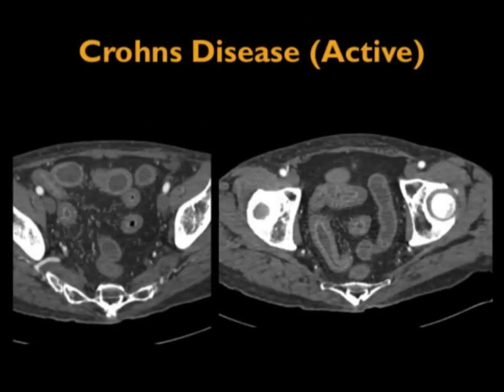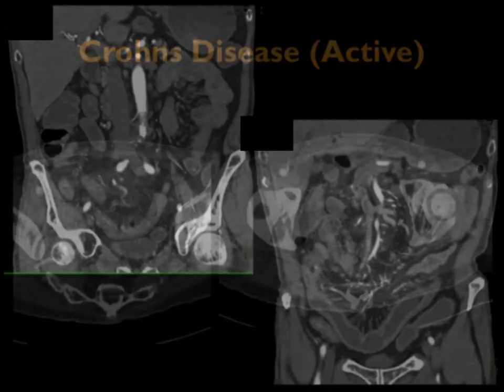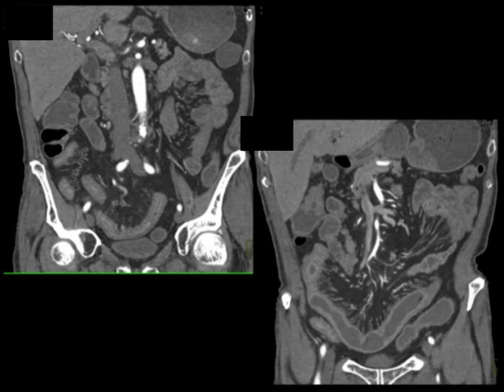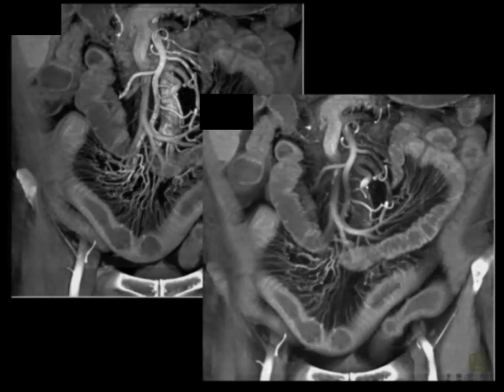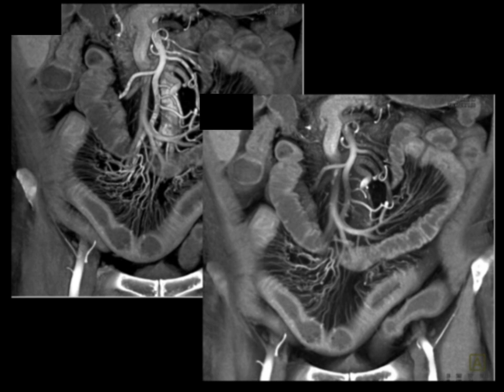In a patient with Crohn's, on axial imaging I see the thickened bowel. If I simply go to coronal, I appreciate the extent of thickening and prominent vessels better. With MIP imaging, I really appreciate the vasa recta — indicating increased activity and active Crohn's disease. And with volume rendering, I have not only the vessels but also the strictures in the bowel. A combination of volume rendering, MIP, coronals, axials, and sagittals for the mesenteric vessels is the way to go.